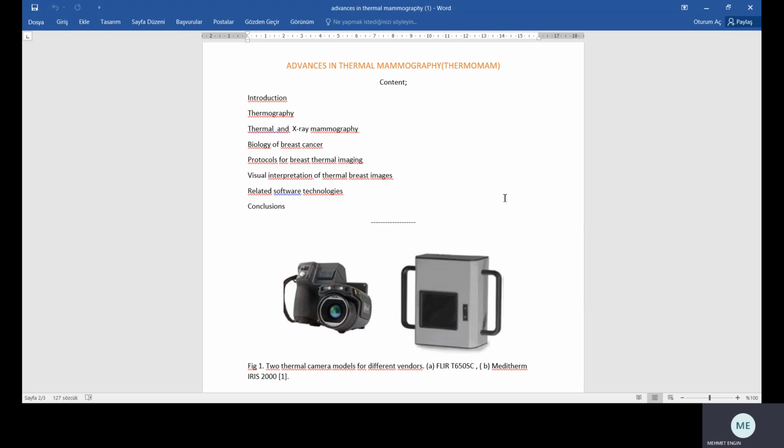Now, advances in software technology. Visual observation and heuristic categorization are subject to human error and variation from subjective interpretation. To solve these problems, there are automated and semi-automated approaches for diagnostics.